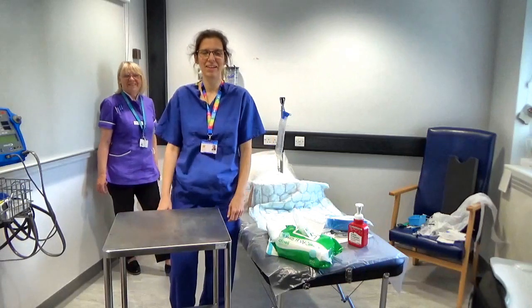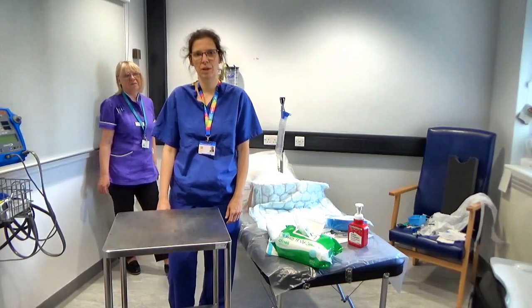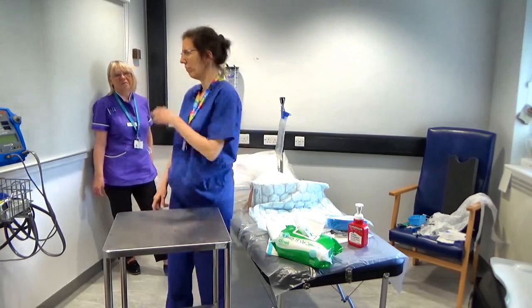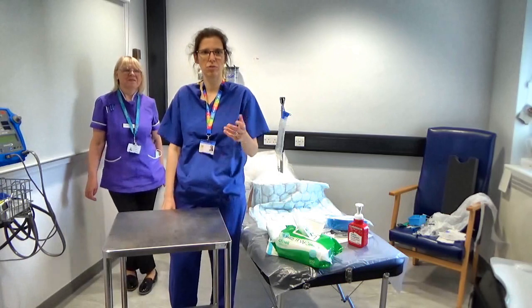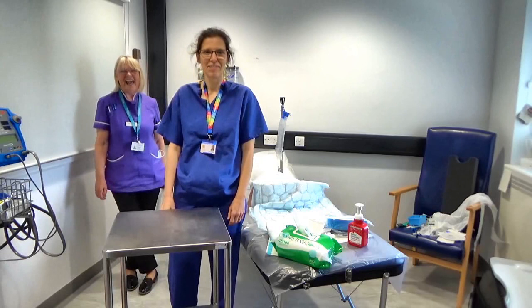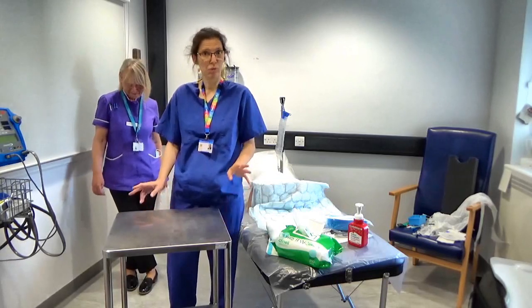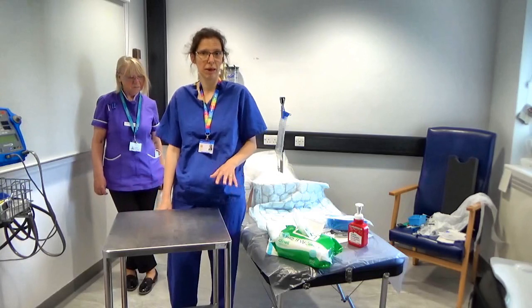Hello, my name is Susan Lionel and I'm a surgical teacher within this trust. I'm helped by Chris Hall, who is the urology lead, and John Swapford, who is our cameraman. Today we would like to show you how to perform a catheterisation in a female and a male model.